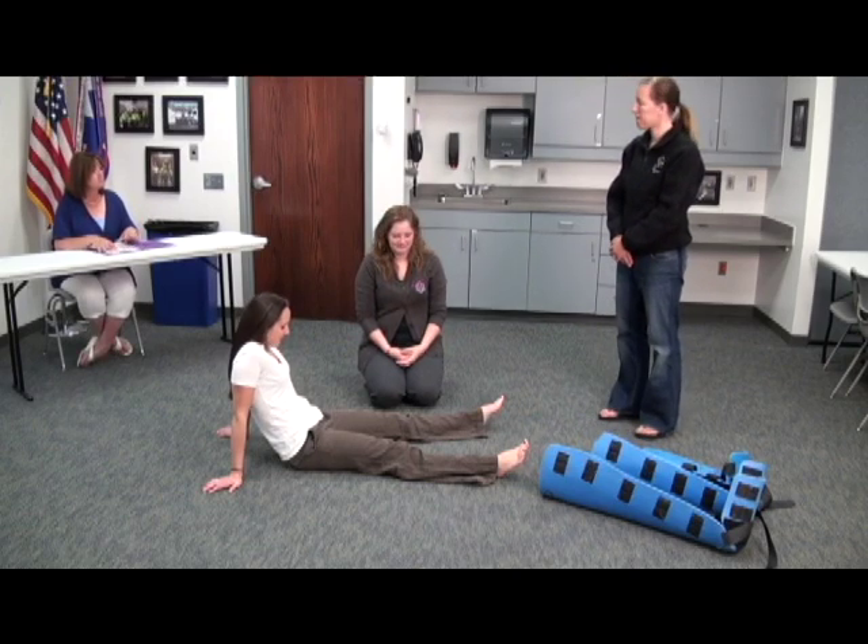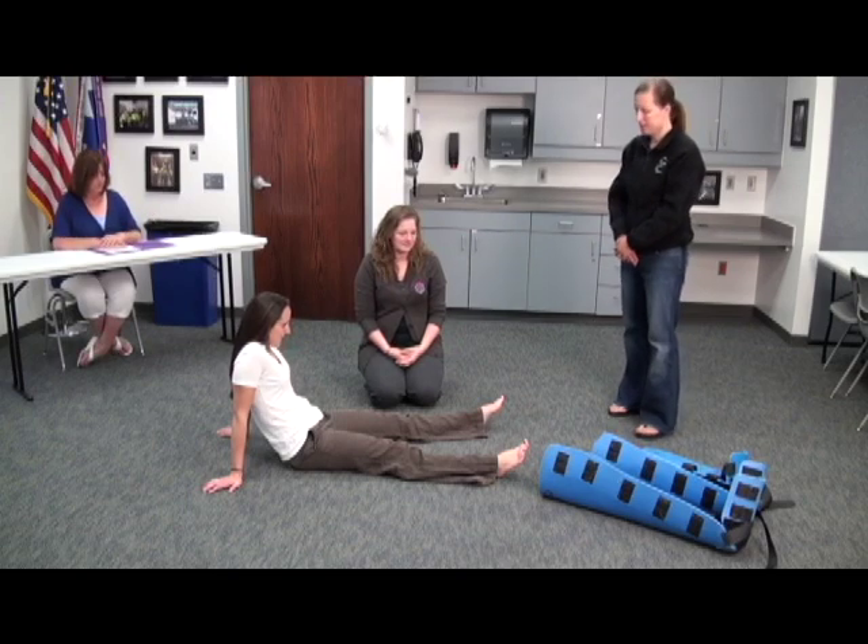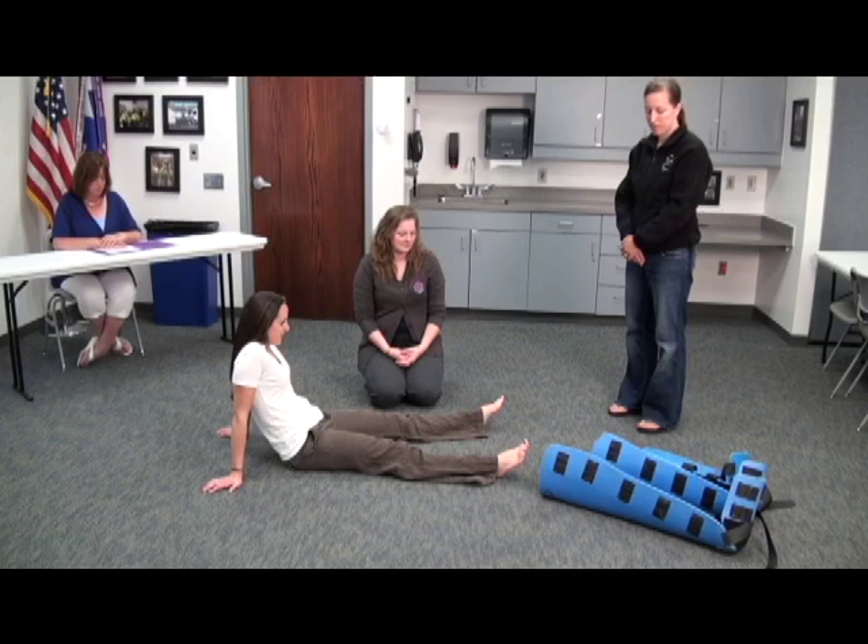I will be reading you the instructions, and feel free to look over the equipment while I'm reading to you. This skill is designed to evaluate your ability to properly immobilize a closed, non-angulated, suspected long bone fracture.